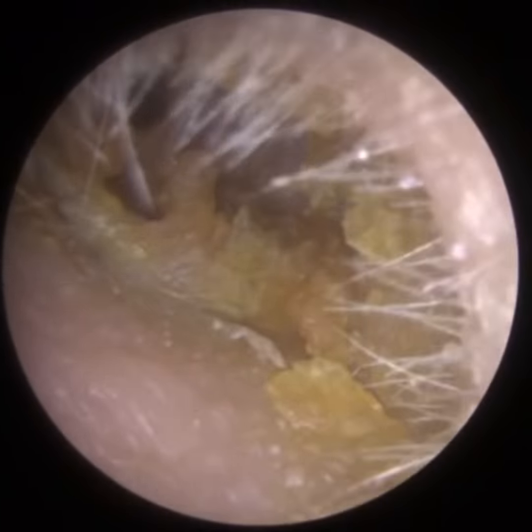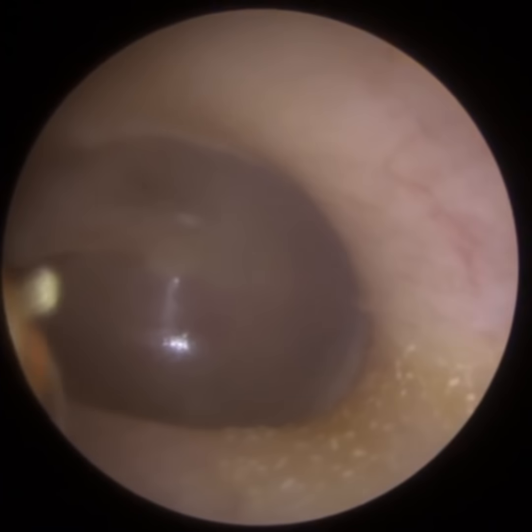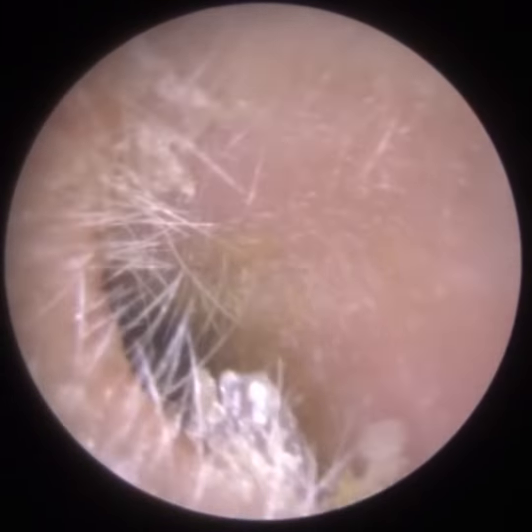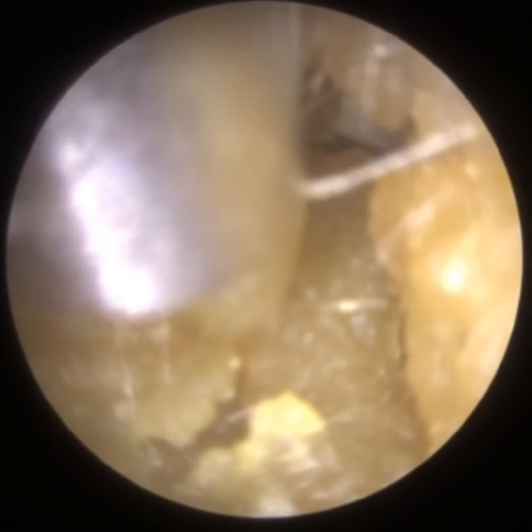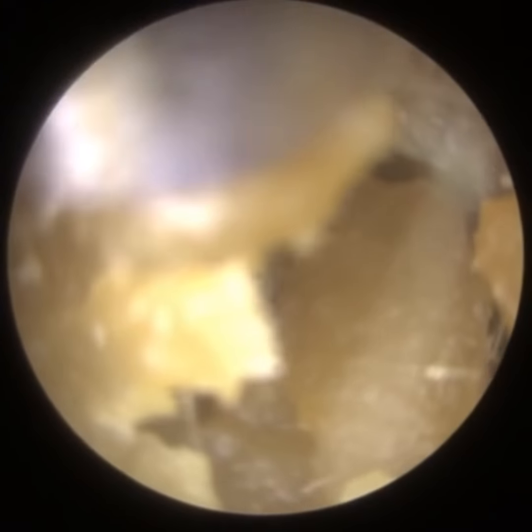So the patient who attended with bilateral otitis externa, the patient's right ear is the worst of the two. This is the patient's left ear that we're just examining. So we're going to start off with the right ear, the worst of the two ears, and you can see we're right near the entrance here, and this dead skin and wax is presenting itself almost like a golden colour. Now, dead skin, keratin, generally has this appearance.